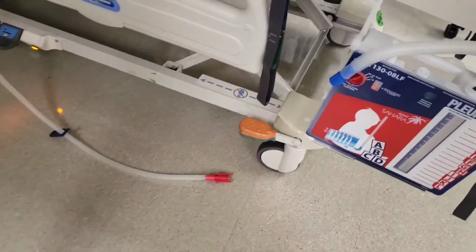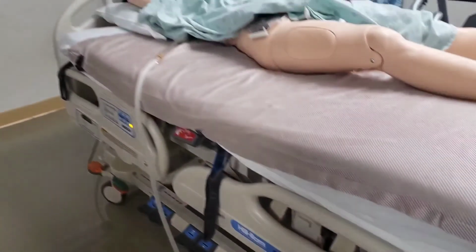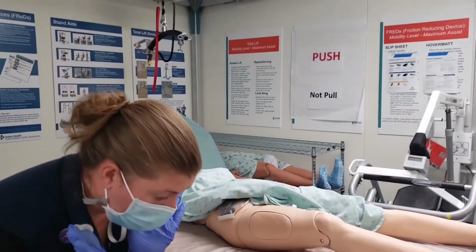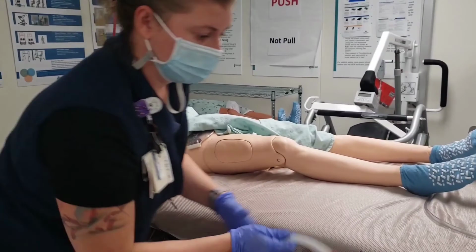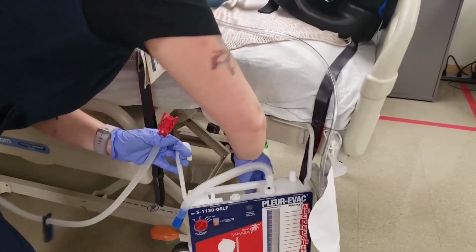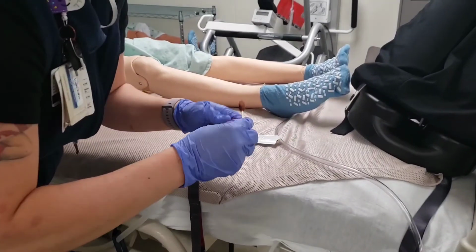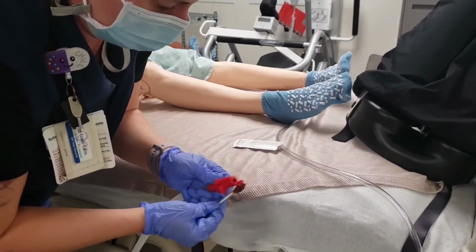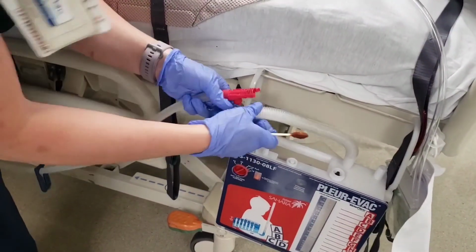If the tubing becomes dislodged from the drainage system, don't panic. Stay calm. Make sure you don't kink the tubing. You don't want to accidentally cause a tension pneumo. Instead, we want to get this hooked back up to suction as quickly and safely as possible, but first we're going to use the iodine to clean both ends before reconnecting. After connecting, assess the patient.